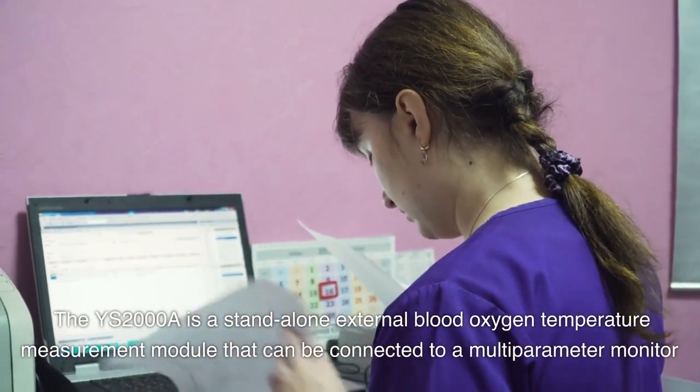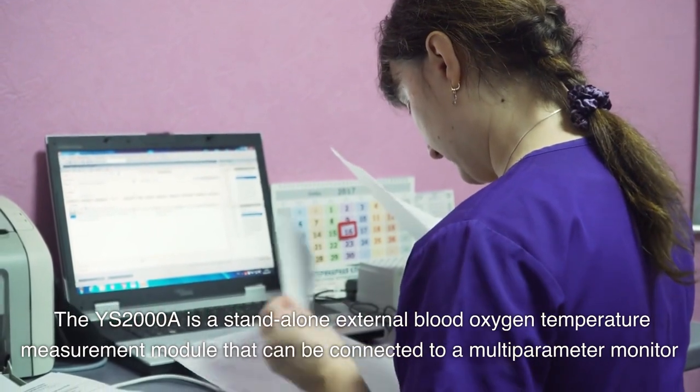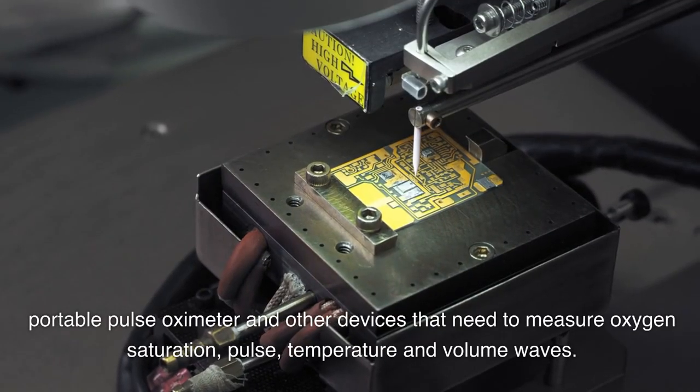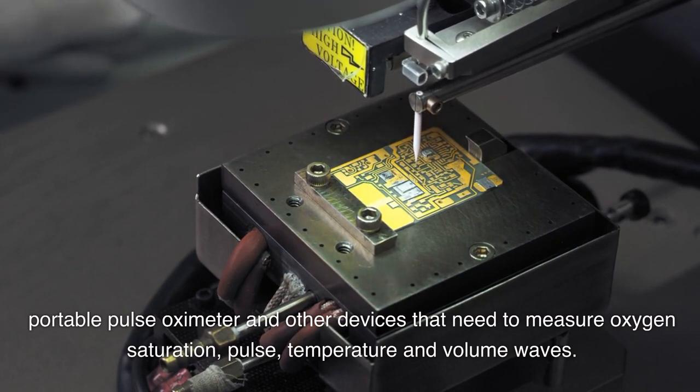The YS2000A is a standalone external blood oxygen temperature measurement module that can be connected to a multi-parameter monitor, portable pulse oximeter, and other devices that need to measure oxygen saturation, pulse, temperature, and volume waves.